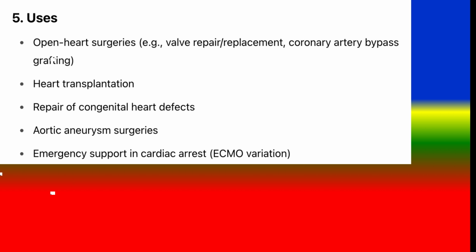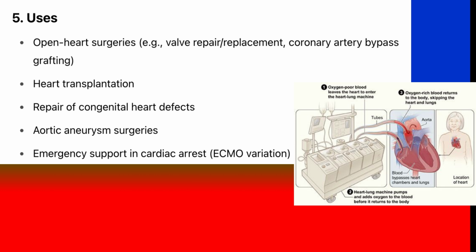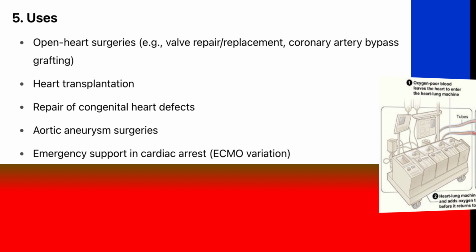5. Uses: open heart surgeries, e.g., valve repair, replacement, coronary artery bypass grafting, heart transplantation, repair of congenital heart defects, aortic aneurysm surgeries, emergency support in cardiac arrest, ECMO variation.